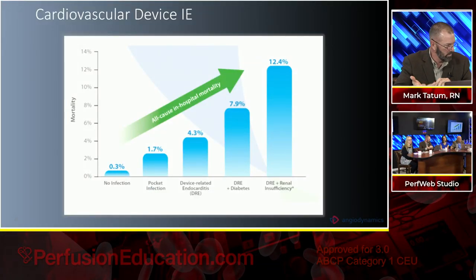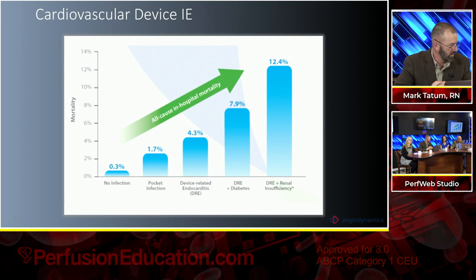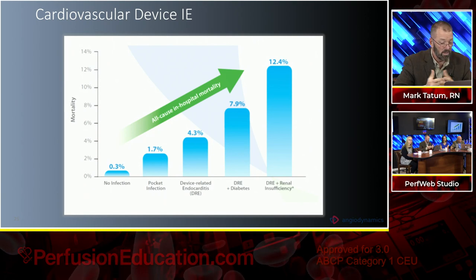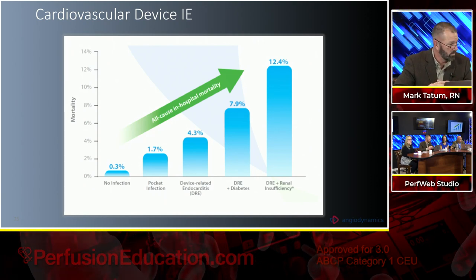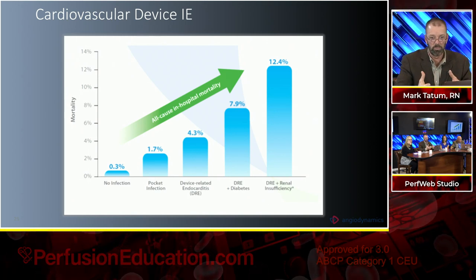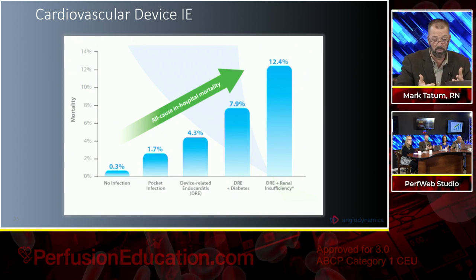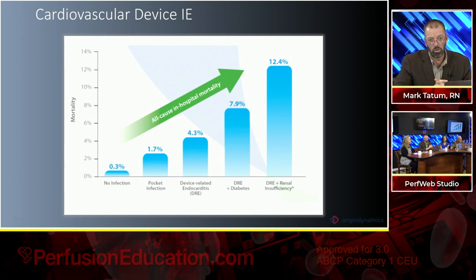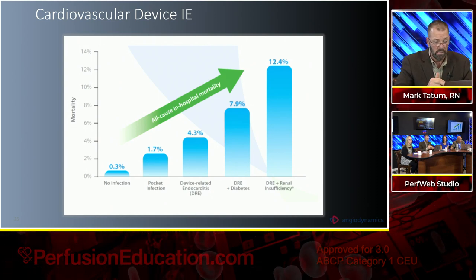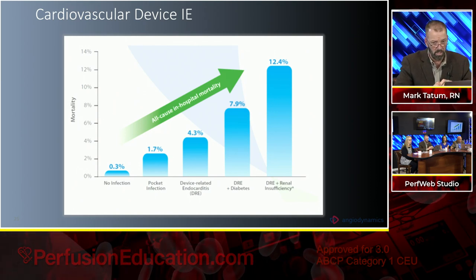And this actually goes to exactly what you're talking about now. If you look at all-cause in-hospital mortality, device-related infection, up to 4.3% now. I mean, wow. It's on the rise. We want to be able to provide something that in a study-based environment allows us to prove what it is that we think we're going to be able to do. To Joe's point earlier, anecdotally, we want to show and prove that what we're doing makes a difference in the long-term mortality of these patients by making a reduction in that. And we're working on those processes now within our own company to begin that study.